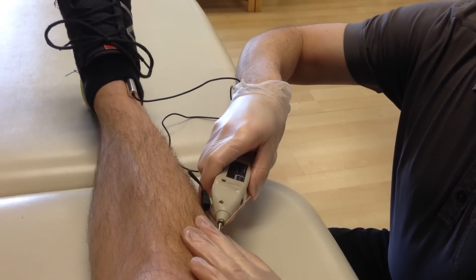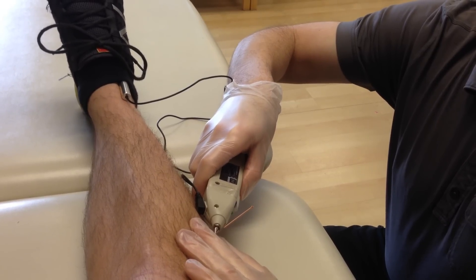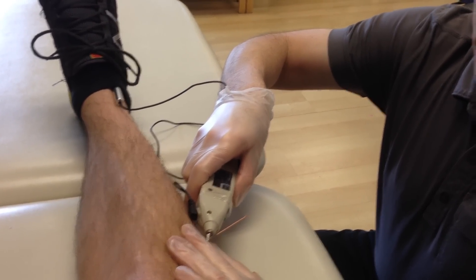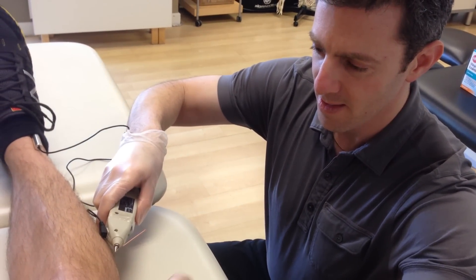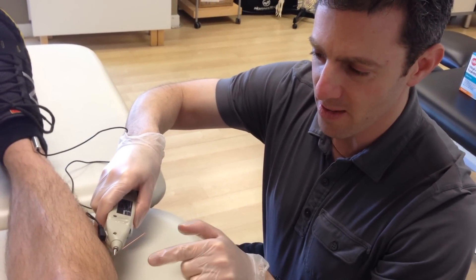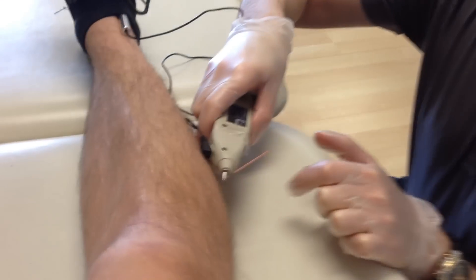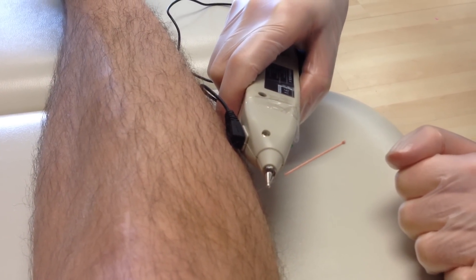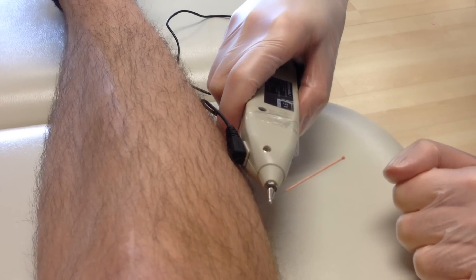We're going to turn this on, and we turn until we start to see a bit of a twitch. The patient will start to feel the muscle twitching. And if you change the angle a little bit, you'll be able to see right there that muscle contracting. I do that for about 10 to 30 seconds — I want a nice, consistent, smooth pulse.